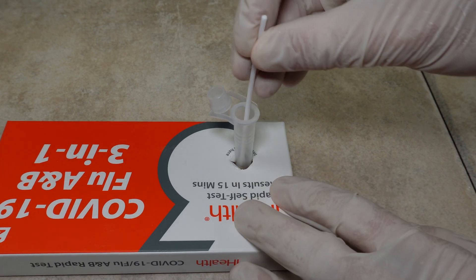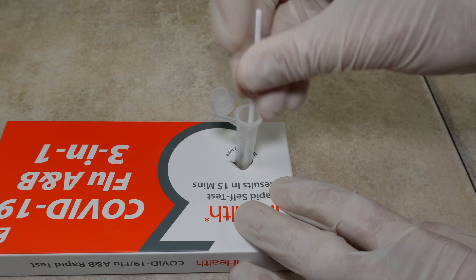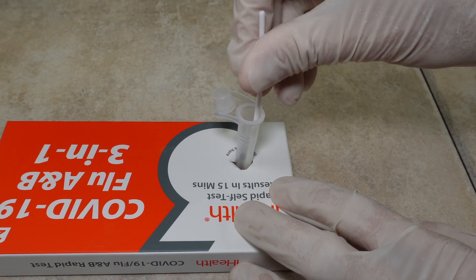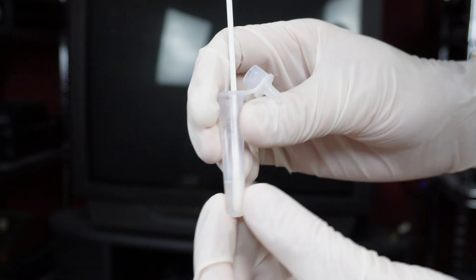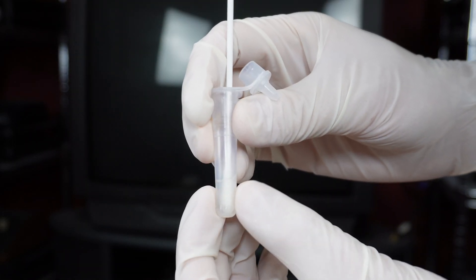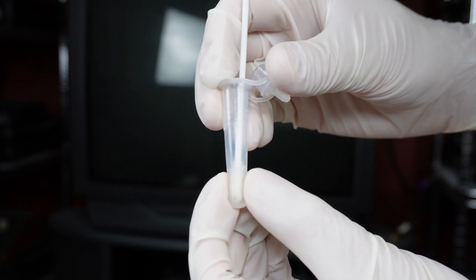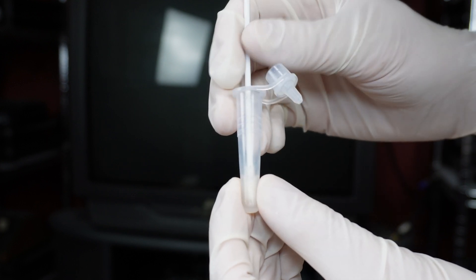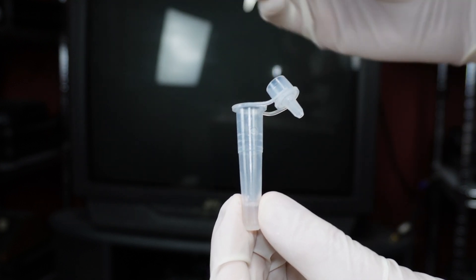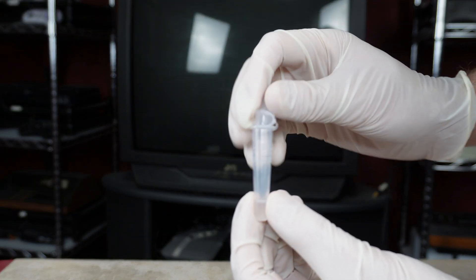Then take the swab and drop it all the way into the tube and stir it 11 times, forcefully against the inside of the tube. Then remove the tube from the box, keep the cotton swab in place, and squeeze the head of the cotton swab five times — the idea is to just stir things up a little bit. Then take the swab out and throw it away, and place the cap onto the tube.